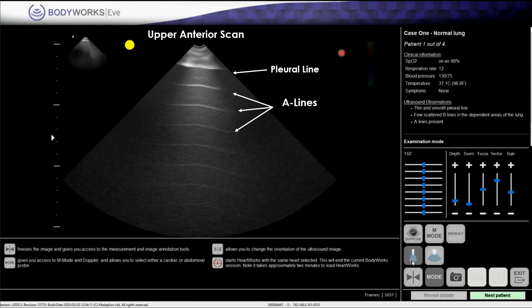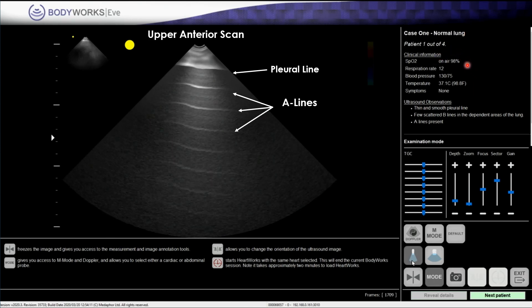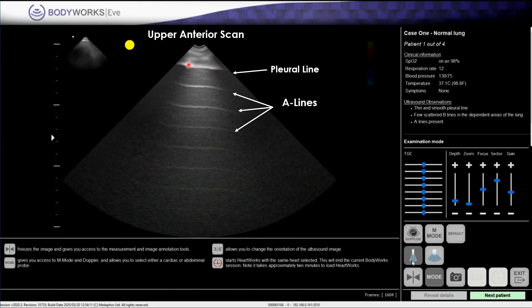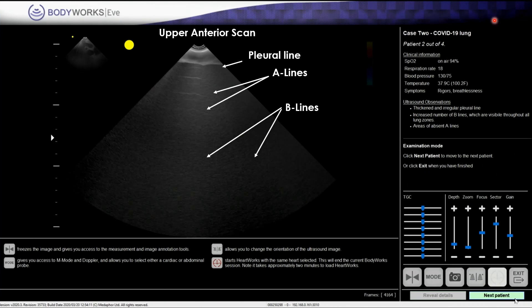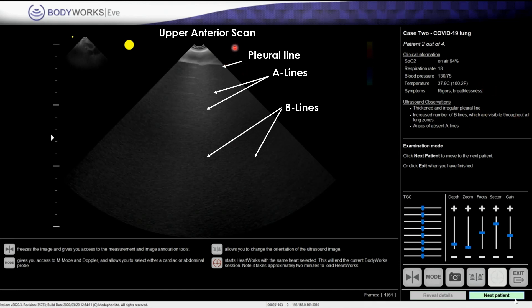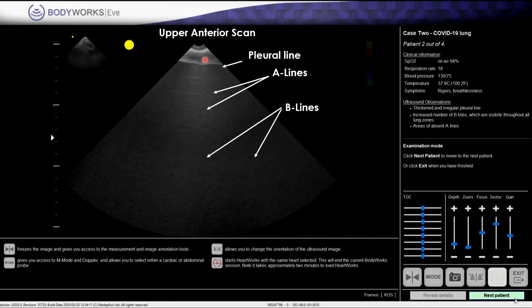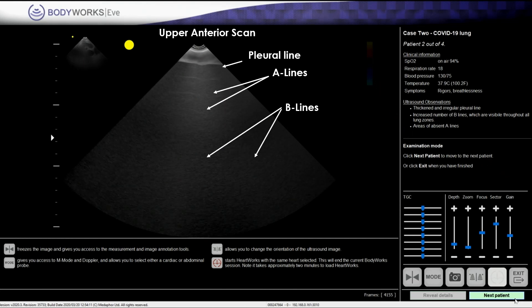This is a normal scan. In the first case, the patient has room air sats of 98%, good blood pressure, slightly febrile, with a nice thin pleural line, nice A-lines, and no B-lines or consolidation. This is an upper anterior scan in region one. Moving to a different patient presenting with room air sats of 94%, normal blood pressure, a temperature of 100.2°F with some breathlessness: in region one you can see a slightly thickened and irregular pleural line with an increased number of B-lines and areas lacking A-lines — suspicious for COVID-19 presentation.